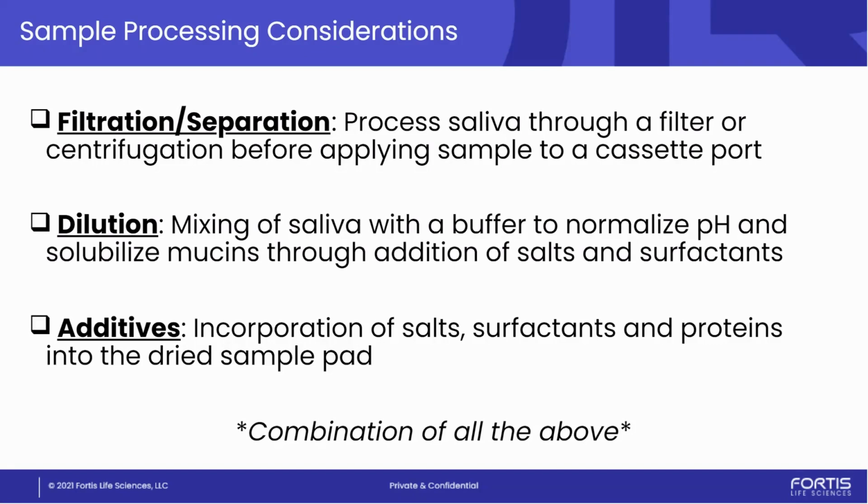So you have to be very careful that pathway is only suitable for qualitative tests. And if you want to do quantitative, then dilution becomes even more tricky because it's only a fixed volume into a fixed volume in order to achieve that calibration you've built into the product.